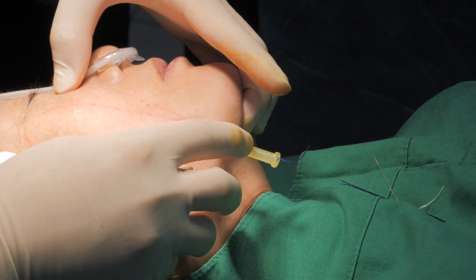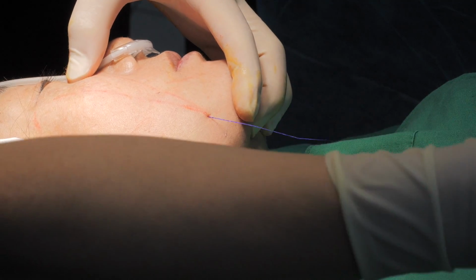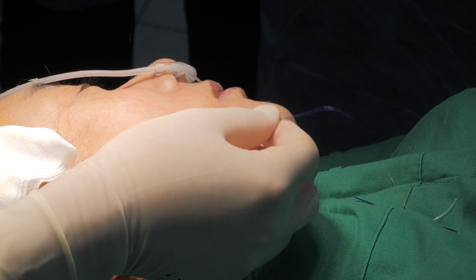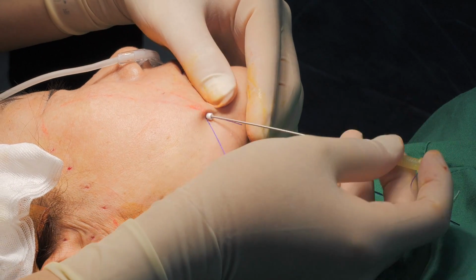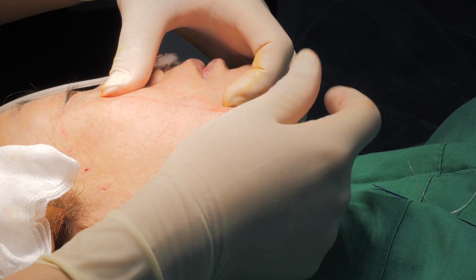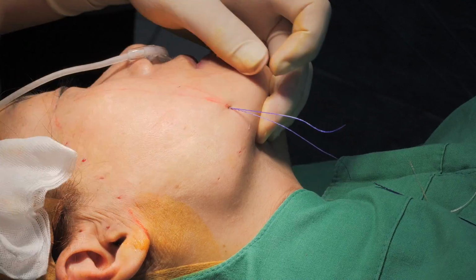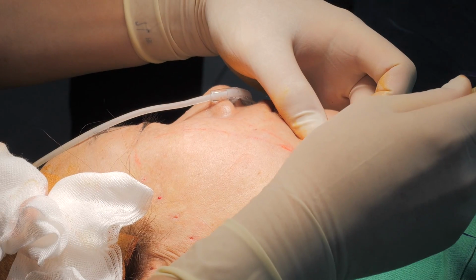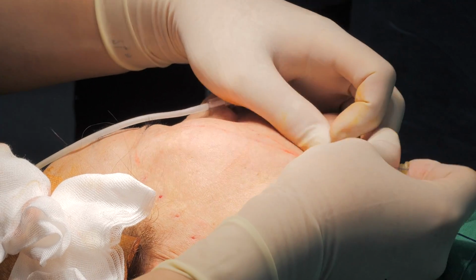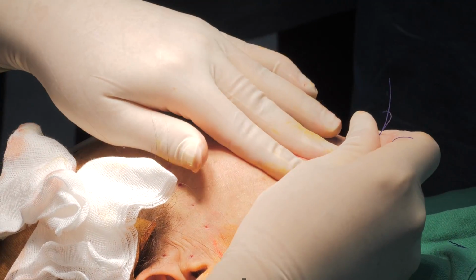When the cannula end reaches the targeted point, you should twist 1 or 2 rounds before removing the cannula to fix the thread on that point. Pull the thread a little bit more.